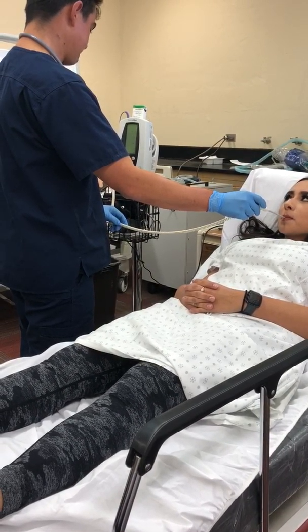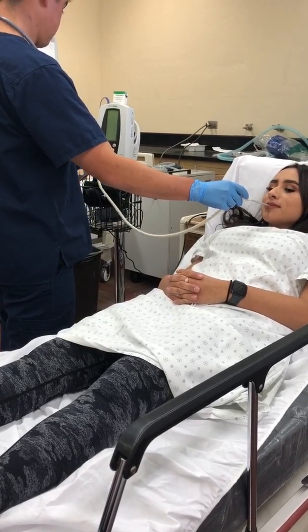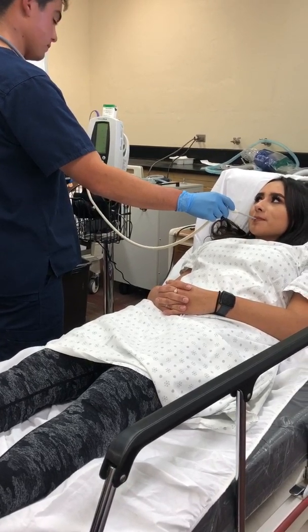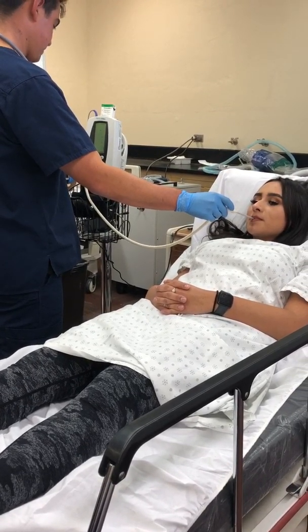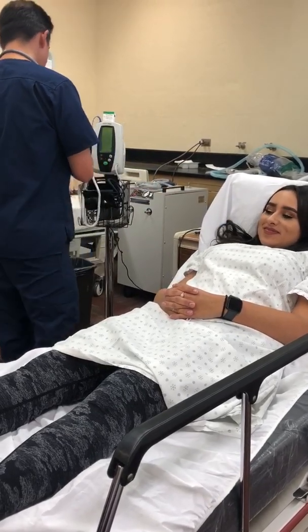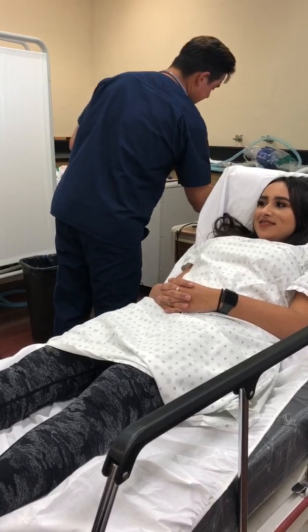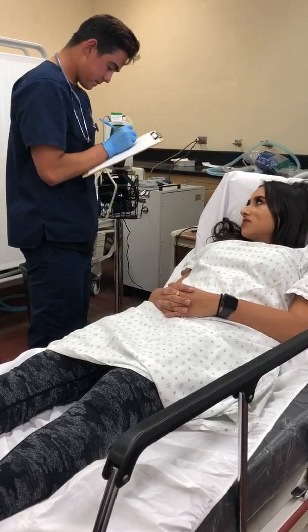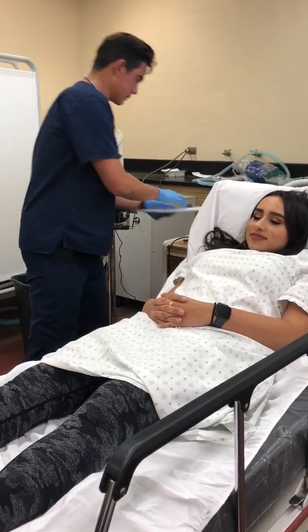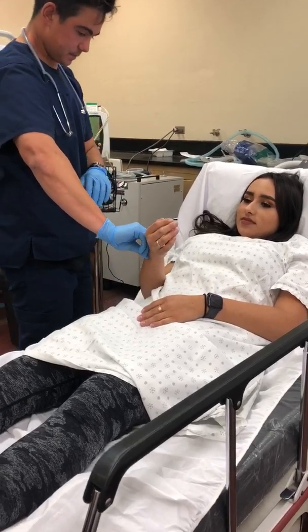Mm-hmm. Okay, thank you very much. I'm going to record our temperature, 98.6 Fahrenheit. Alrighty, I'm going to go ahead and take your pulse now for 1 minute, alrighty?